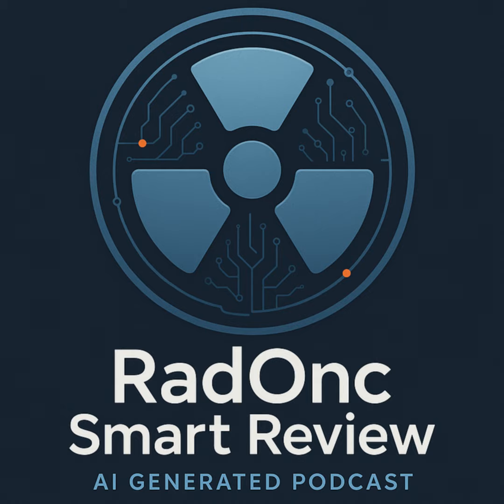You need that penetration. Okay, so let's try to summarize that trade-off. It's crucial. High frequency equals high resolution but low penetration. And low frequency equals low resolution but high penetration. Got it. That's the mantra you have to remember when choosing an ultrasound probe or evaluating an image. Did they use the right frequency for the job? Okay, that makes sense. So we send a pulse. It reflects off interfaces based on impedance differences, and we choose the frequency based on depth versus resolution needed.